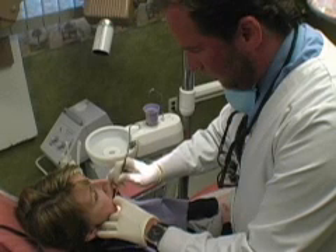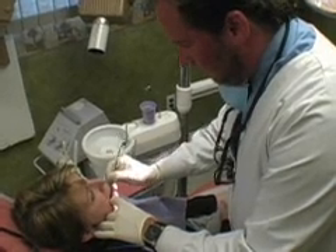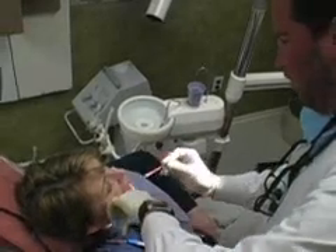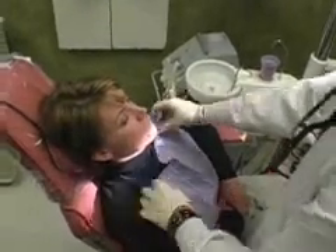I'm here with Sheila and she has a sensitive tooth, so I'm going to do some tests. I'm going to tap on the tooth to see if it's sensitive, and it is. Then I'm going to try some cold stimulus called endo-ice. We'll put a little endo-ice on the tooth, and with endo-ice, if it's sensitive — and it is — we're going to go ahead and start root canal.